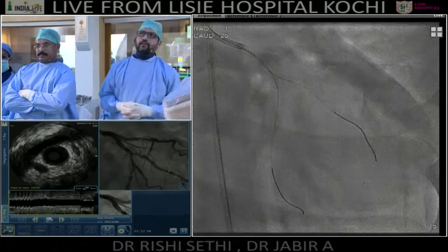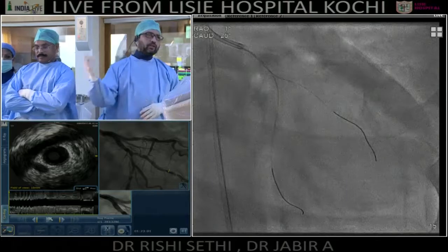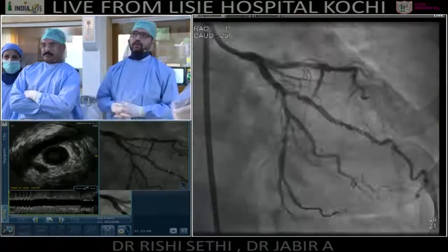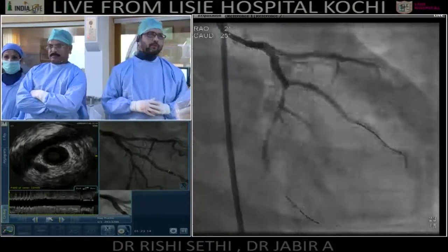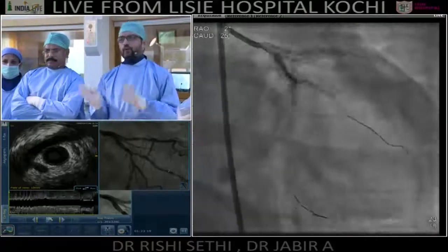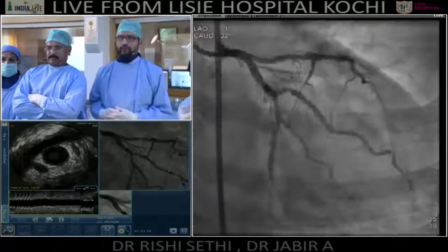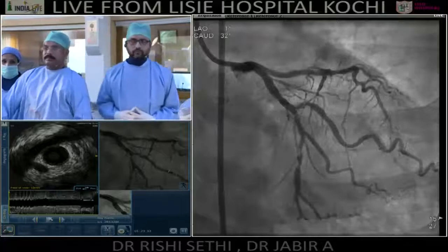Dr. Panja, this is not a primary setting. It's clearly an old stented vessel, and he has demonstrated ischemia on TMT. So he's TMT positive now. So basically, you asked us the question, which of these three lesions? You asked as to the IFR or the FFR, as I understand. Basically, if you were to look angiographically, I would say the OM lesion looks pretty tight to me. It's a big vessel, and I would expect a positive FFR or IFR over there.